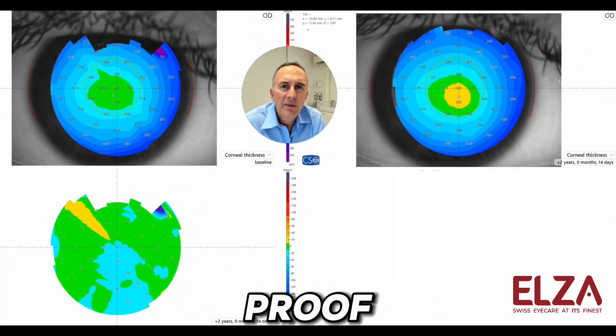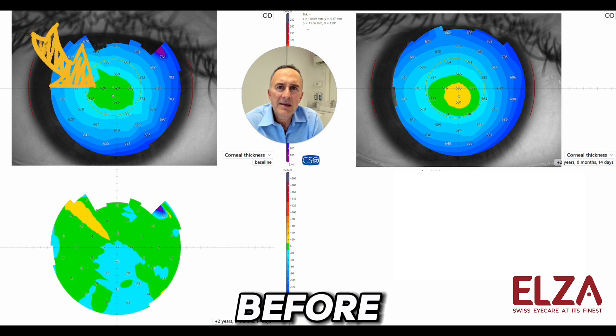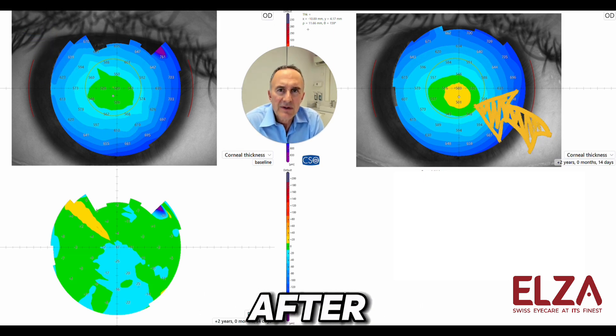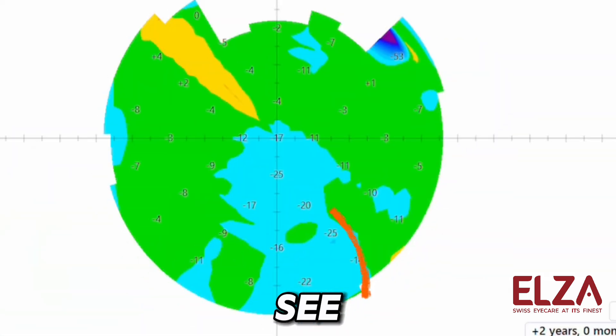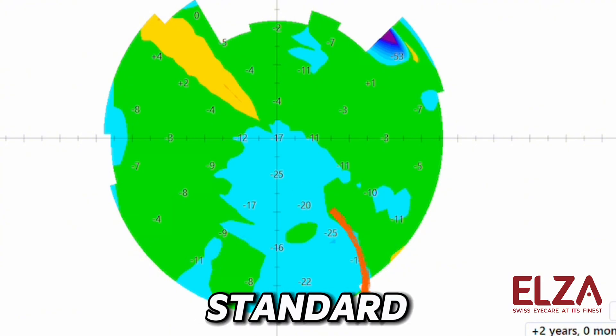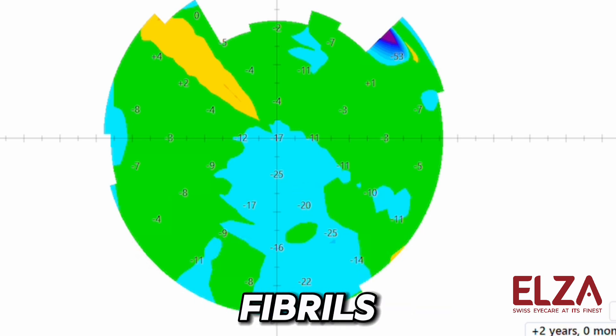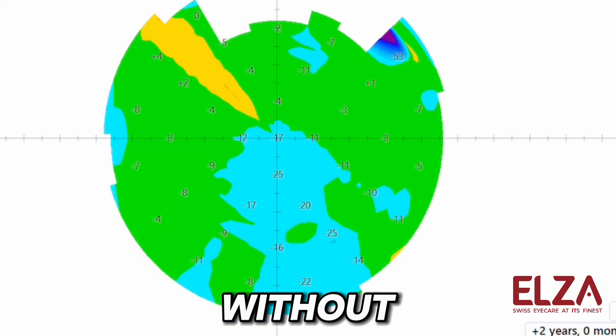Here is the proof. You see the total cornea thickness in the upper left before Elsa Pace, and on the right side two years after Elsa Pace. In the lower left, you see the difference, which is between 20 and 30 microns. That's a typical difference even for standard conventional cross-linking, because the packing density of the collagen fibers increases. So the cornea appears thinner without any tissue removal.